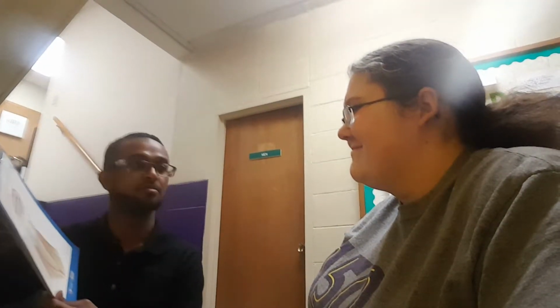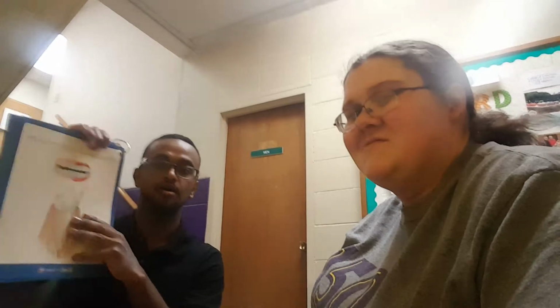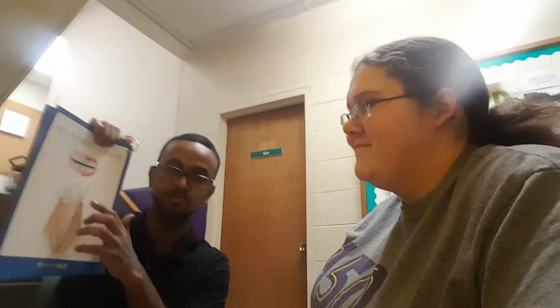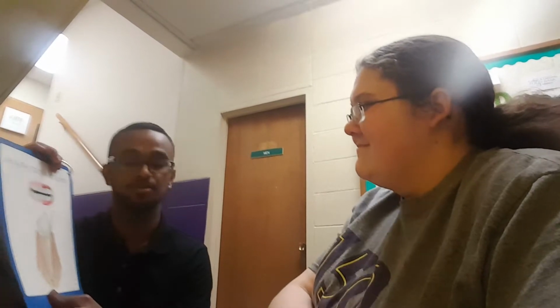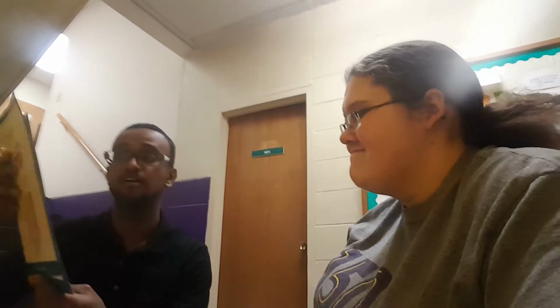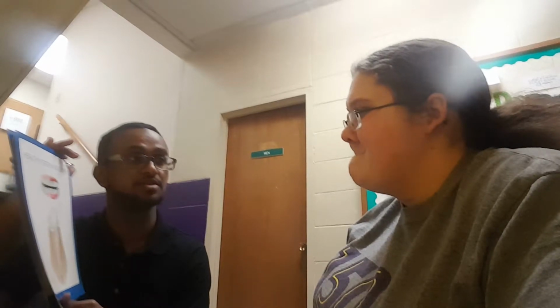Hi Banu, so today I'm going to be measuring your gum depths using a millimeter measurement tool. 1 to 3 millimeters, as you can see here, from this to the black spot right here, is normal. Above 3 millimeters indicates periodontal infection. Now if you have a depth above 3 millimeters, then you would need a more advanced cleaning than a regular cleaning.